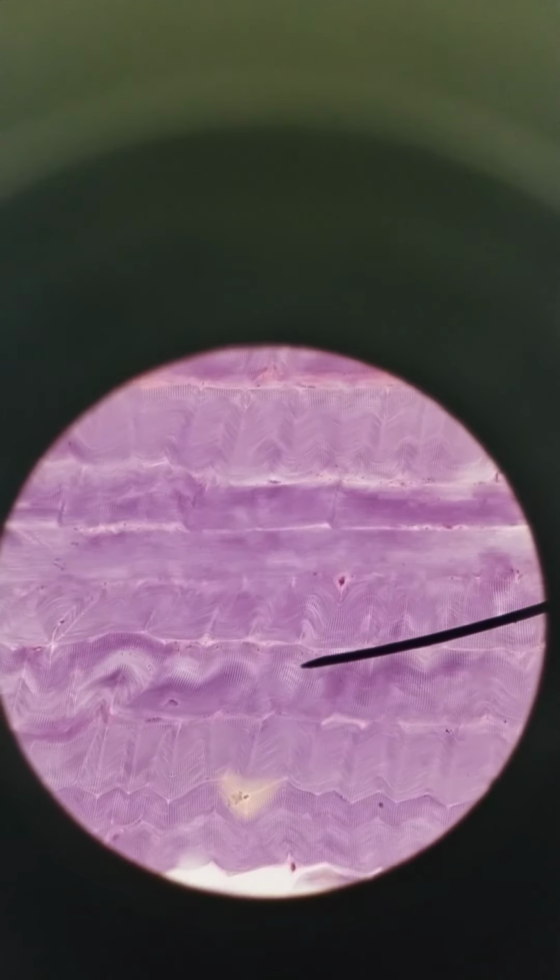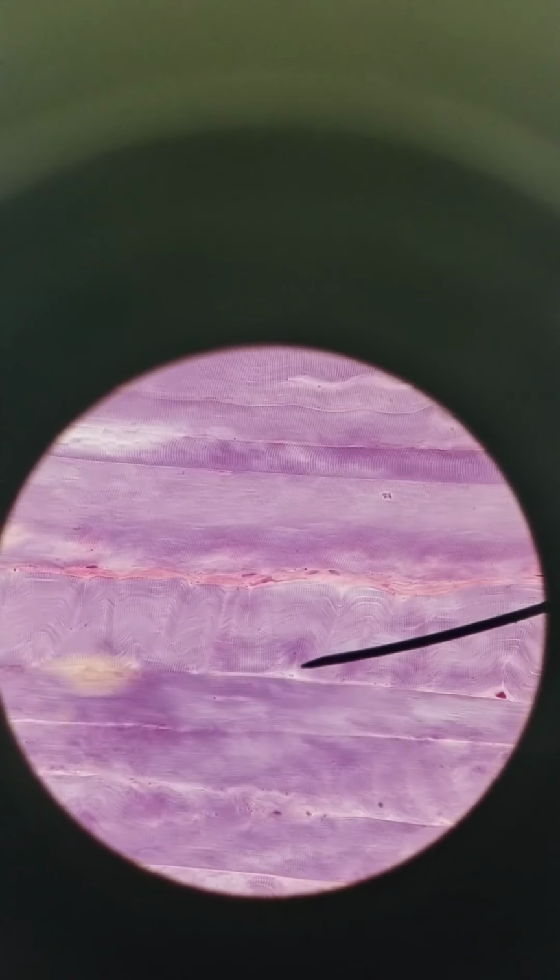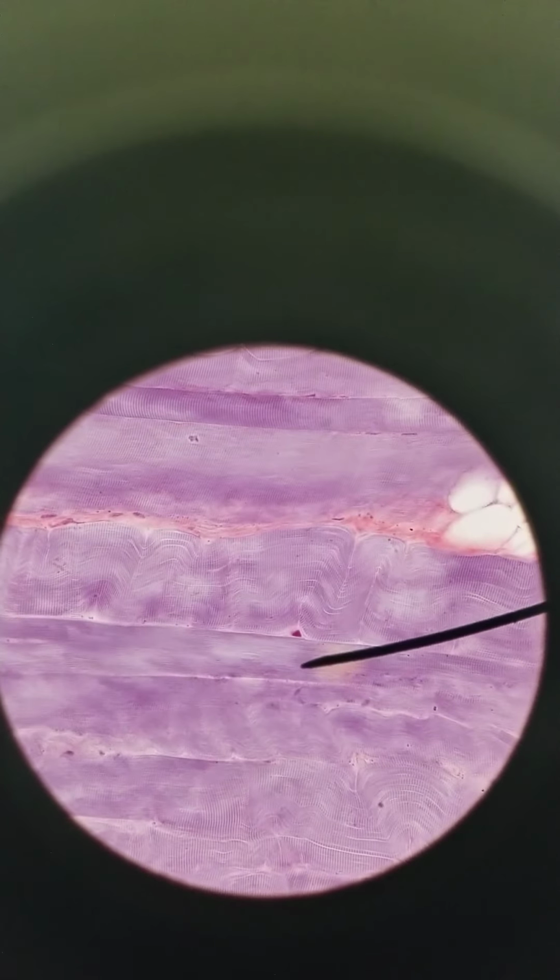So we can see multiple nuclei. Here's the best example. Here's one nucleus. Here's another. Here's another. There's another. Many, many nuclei. With more nuclei, that means more DNA. With more DNA, that means more RNA. With more RNA, that means you can make more protein. And proteins are really, really important for skeletal muscle function.